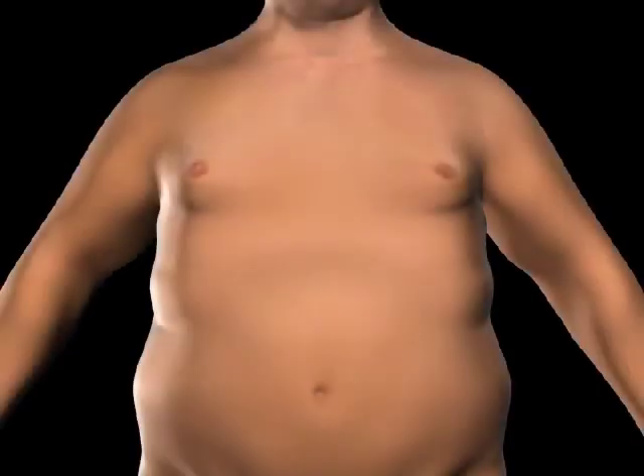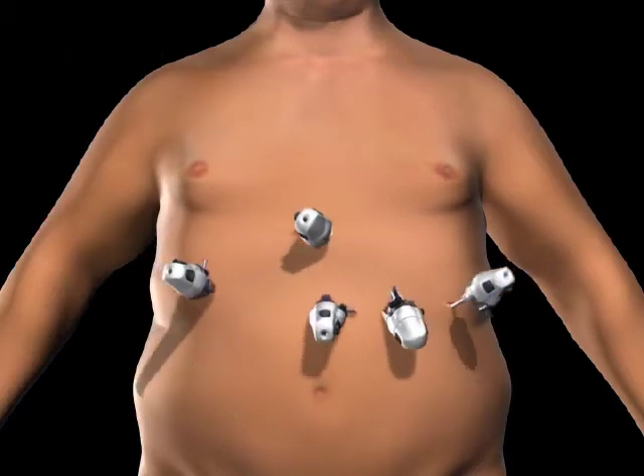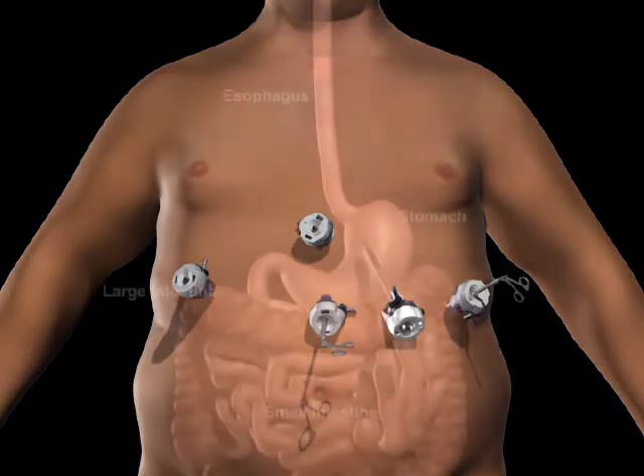To gain access to the abdominal cavity, small incisions are created on the abdomen. Trocars, which serve as passageways for the surgical instruments, are placed into the incisions. The surgical instruments are placed through the trocars into the abdominal cavity.